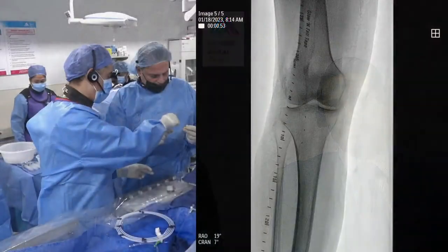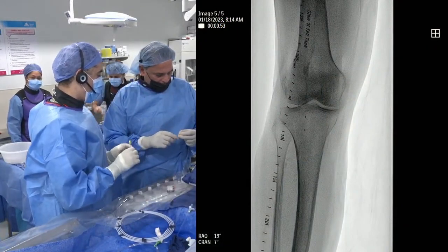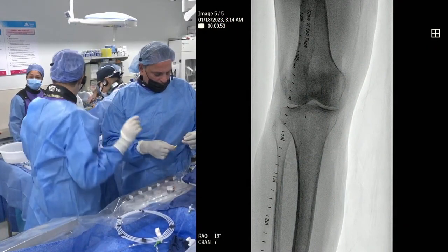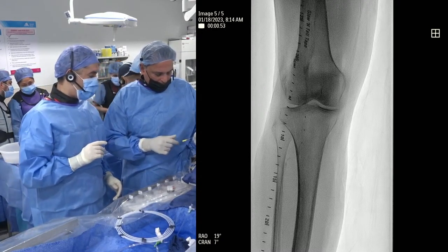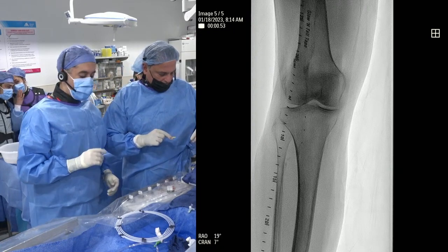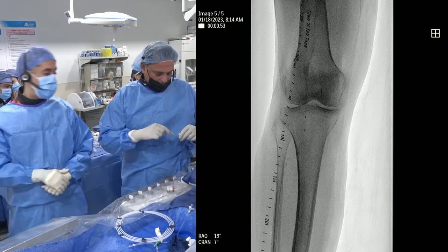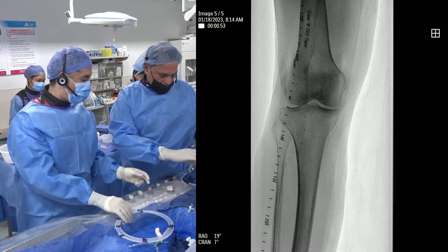For endarterectomy, that's a good point, but it would be challenging just because it's a reoperative field. Sometimes you don't get a nice plane when you go back into the common femoral and you can't really do an endarterectomy. Sometimes the tissue can be friable and you might have to replace it with graft. So it's certainly an option if we couldn't do endo or if we get a suboptimal result. But in a reoperative field, I think an endo approach is reasonable.